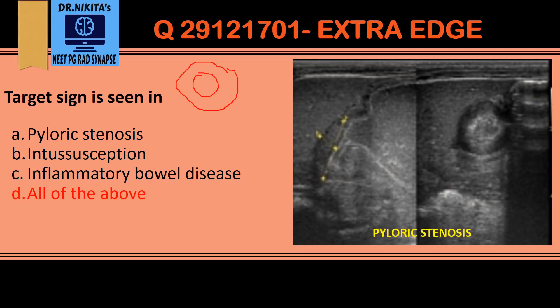In pyloric stenosis, on this ultrasound image, we can see the stomach, the liver, and the pylorus. The pylorus is elongated and thickened. If we take a transverse section, we see the inner circle, which is the lumen of the pylorus, and the outer circle, which is the thickened muscle layer. That is why we get a target sign in pyloric stenosis.